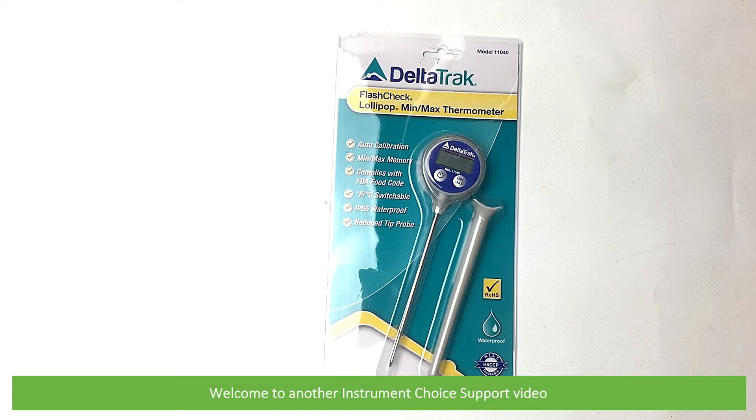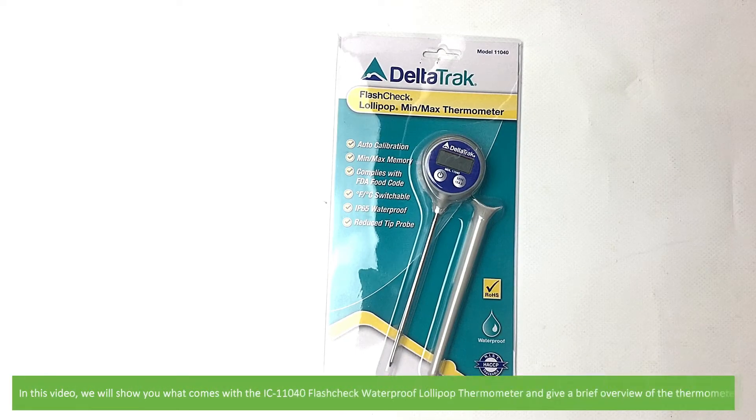Hi and welcome to another Instrument Choice support video. In this video we'll show you what comes in the box with the IC-11040 Flash Check waterproof lollipop thermometer and give a brief overview of the thermometer.